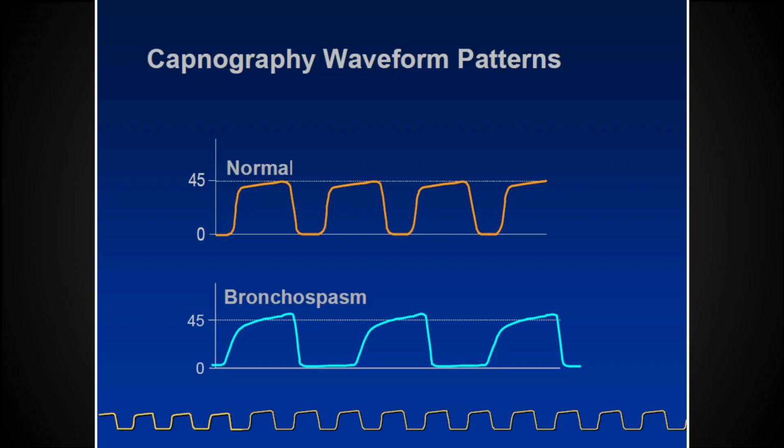Right? And so in this case, we've got what happens all the time, especially on certain monitors like a LifePak 12. When you print it, it looks really drawn out and changes the way it appears. The number of times I've had people tell me that the orange one is shark fin is insane, because I think people expect little marching rectangles. And they're like, look at the hook there on the front. I'm like, no, that's normal, because it always takes a little while to get all that CO2 out of your alveoli. This right here is implying that our exhalation is longer.